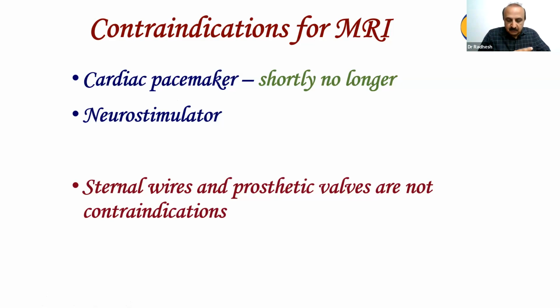But I would like to say we were one of the first to do a study on MR with pacemakers. And it is not far off that patients with pacemakers can be imaged with MR. In fact, we have recently done 2 cases with pacemaker. Only thing here is the pacemaker should be MR compatible. And it is always better that there is a technician because we don't want this pacemaker to behave differently once they get into the magnet. So that is why, though it is MR compatible, we always have a technician by the side.